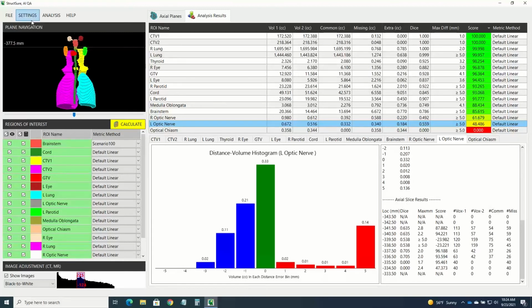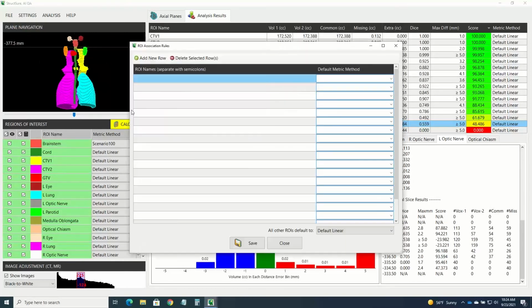your needs. And then you could also put together some rules, and I don't have any here right now, but in DICOM files, the way either human beings or the auto-seg engine name things may be different from one to the next.